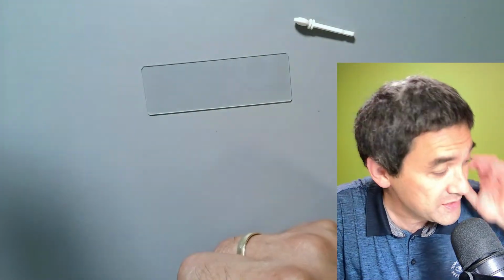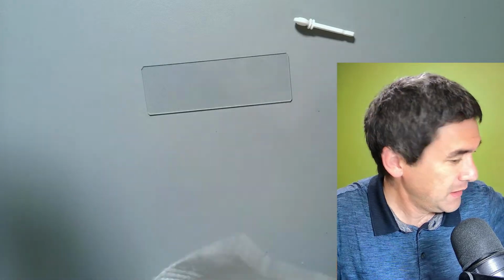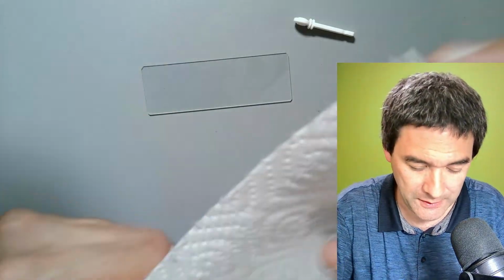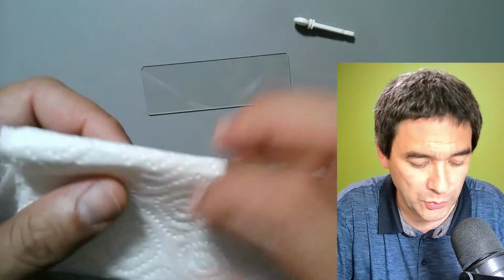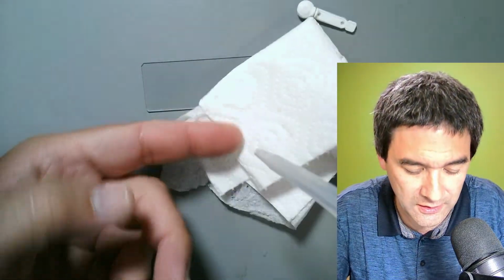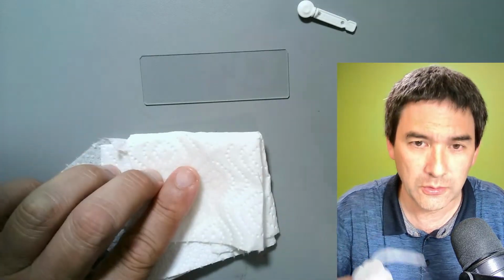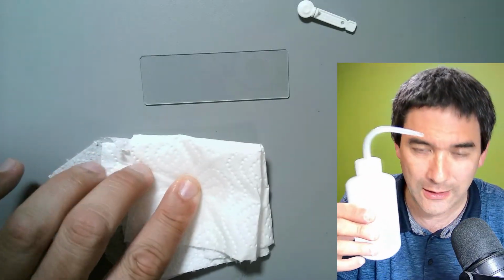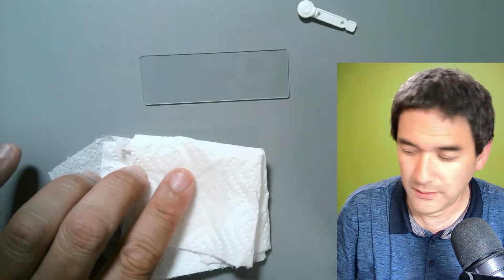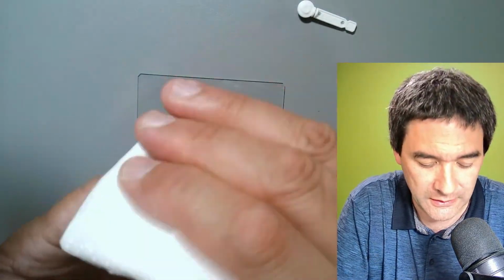And now this is where it starts to become a little bit stressful for me, because I have to hurt myself. Before I do that, I would like to use a little bit of alcohol simply to disinfect my finger, because that's what you're supposed to do. I've got this bottle with alcohol, and I will use it to disinfect myself a little bit.